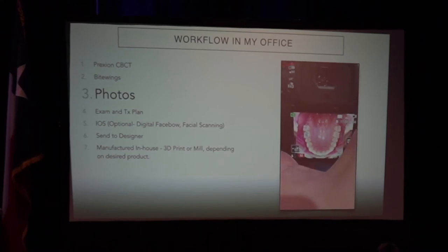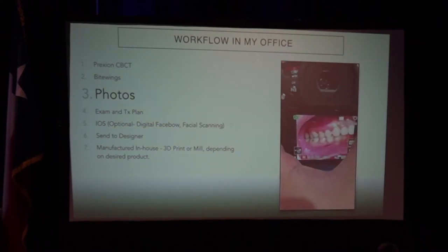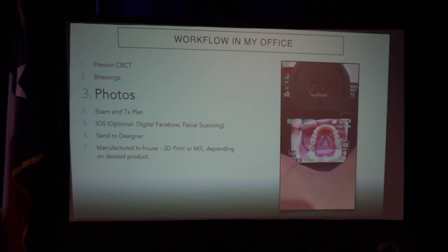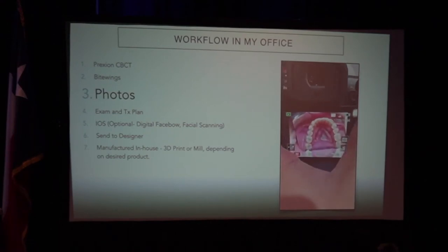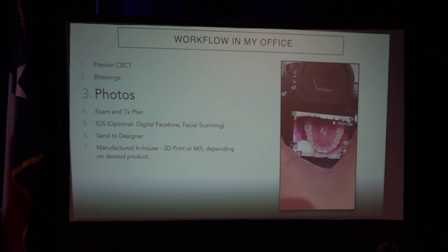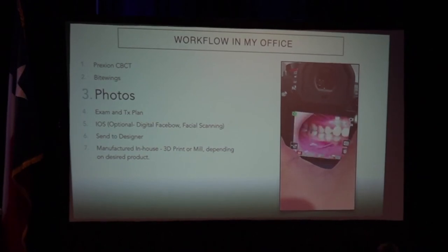Let's play this here. So I was training them to take the photos. These are the ones they were taking. Getting good shots. This one, I told them that it was coming in from an angle. That's not what you want. You come straight like that. Those are angles, but all nice, okay. Bright shots, man.